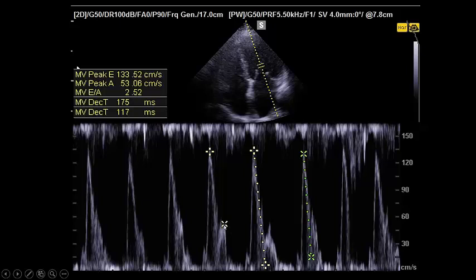That means there is organized atrial contraction now. Is it sinus rhythm or organized flutter? Let us see. But there is a restrictive pattern here denoting increased left atrial pressure. This restrictive pattern, E over A more than 2 in patients with cardiac disease, goes with the restrictive pattern, diastolic function grade 3 and increased left atrial pressure. Is it the case?